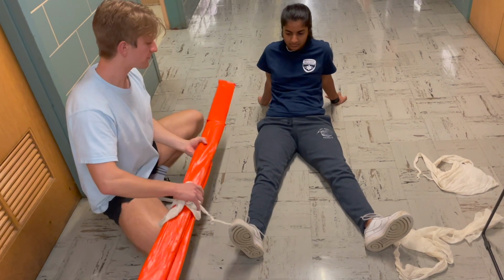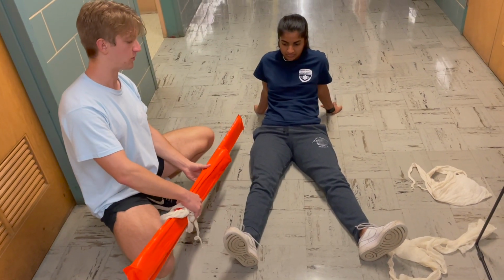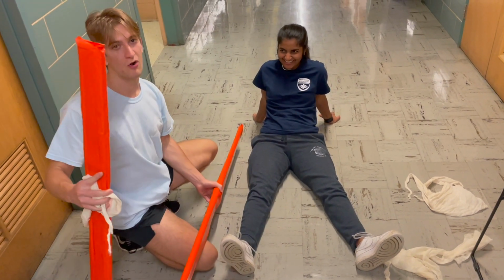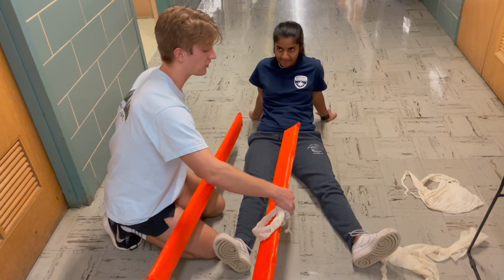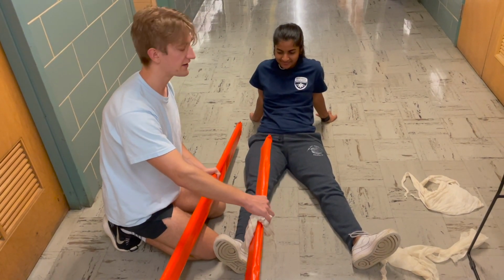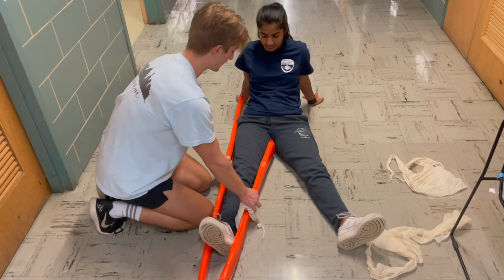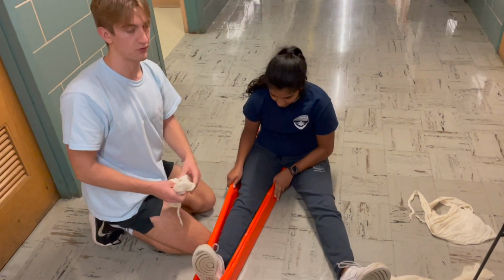So for a typical patient, we may use 2 long boards, but since Ashani has really small legs, bless her heart, we can get away with this smaller board for the center. So remember that splints have a hard and a soft side. There's a cushion padding on one side, so we'll put the padding toward the patient for comfort. And then we will begin the splint. She will help me since there's only one of me right now.